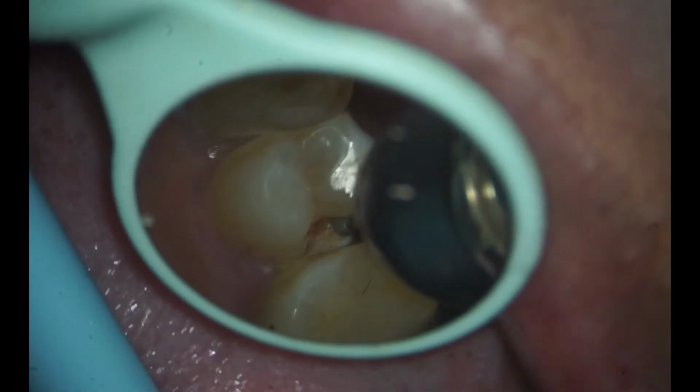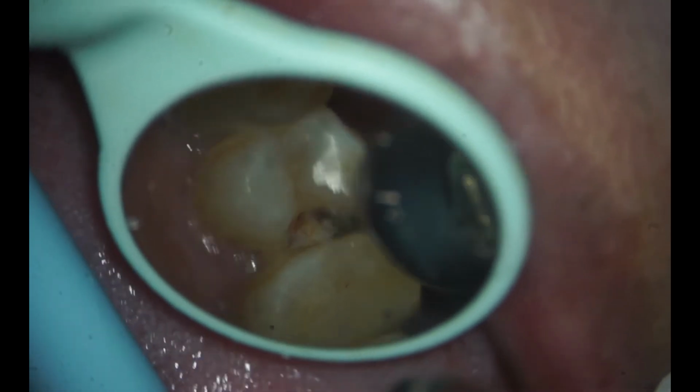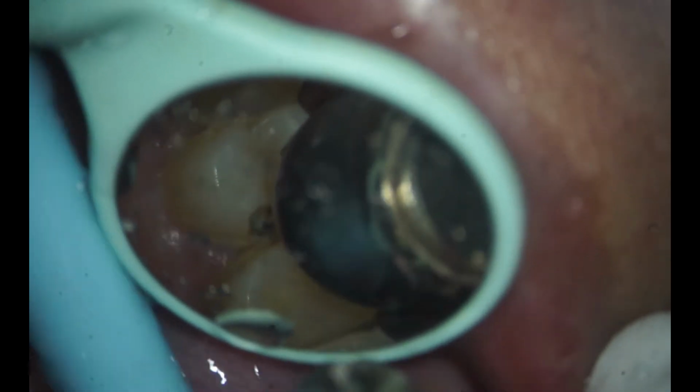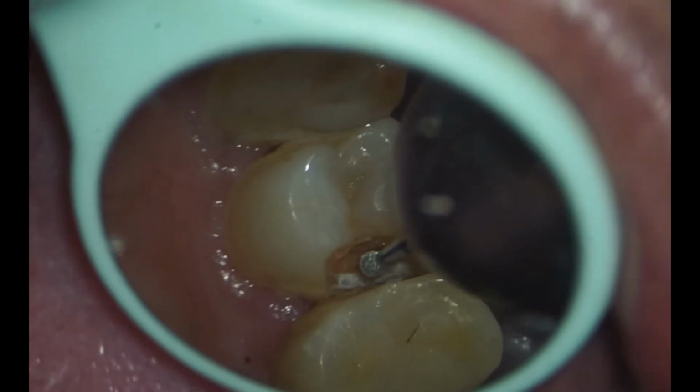So we'll start with excavating the lesion first. We use a round bar. Under water cooling, we are excavating the carious lesion. The good thing was the patient had no complaint. It was an accidental routine finding during the examination and radiographic session. So we told the patient that the tooth needed a restorative treatment and scheduled the appointment.